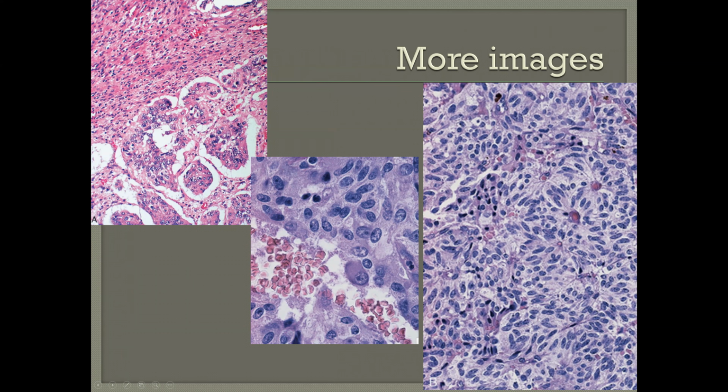So rather heteromorphous appearance to this tumor, and certainly something that you should be on the alert for based on the location. You'd pass by that diagnosis in terms of something further down the GI tract, but in the periampullary area, this is one of the interesting tumors we can sometimes encounter.